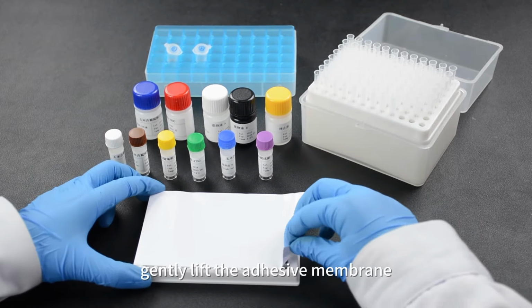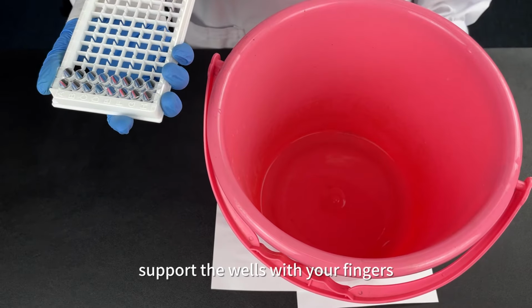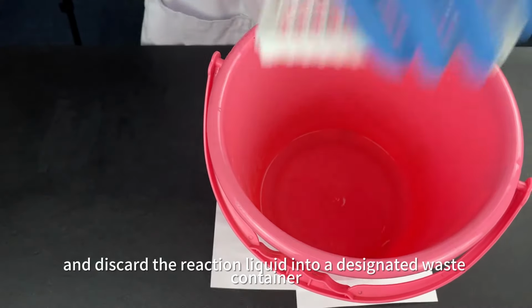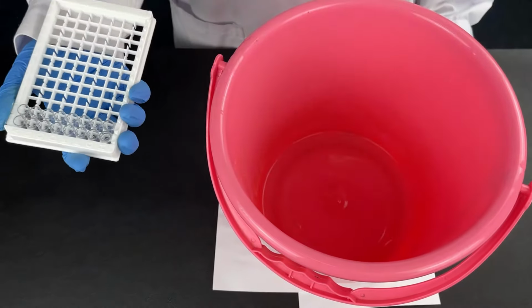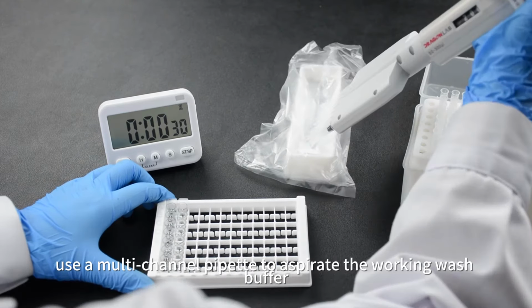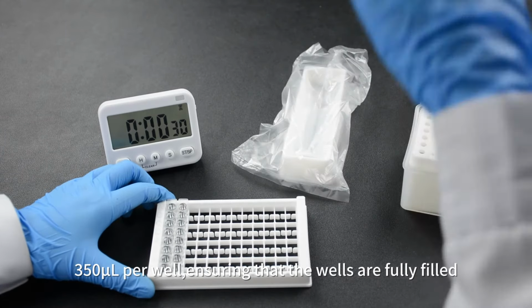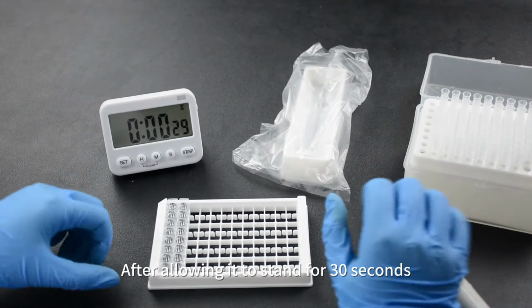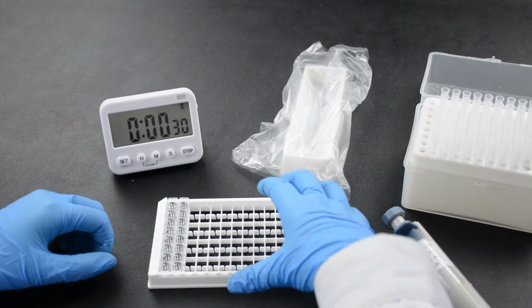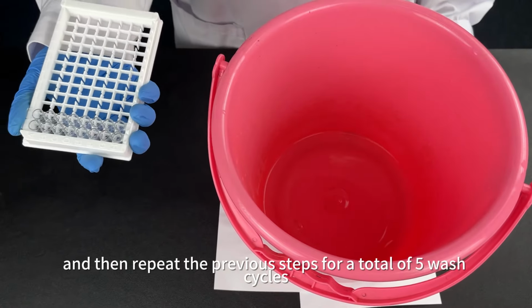Gently lift the adhesive membrane. Support the wells with your fingers, and discard the reaction liquid into a designated waste container. Then, use a multi-channel pipette to aspirate the working wash buffer, 350 microliters per well, ensuring that the wells are fully filled. After allowing it to stand for 30 seconds, discard liquid in the wells. And then repeat the previous steps for a total of 5 wash cycles.